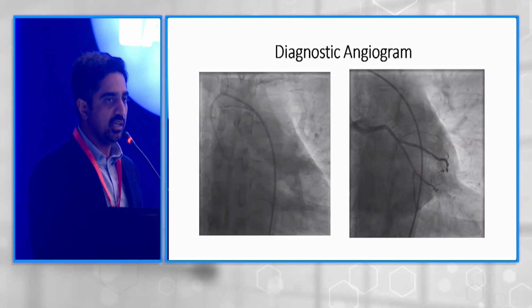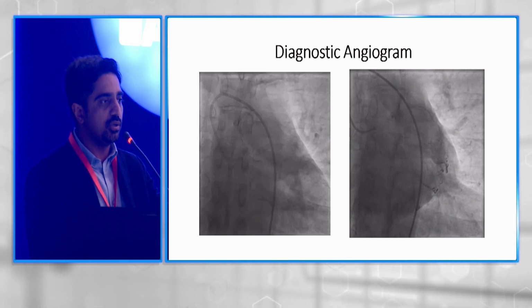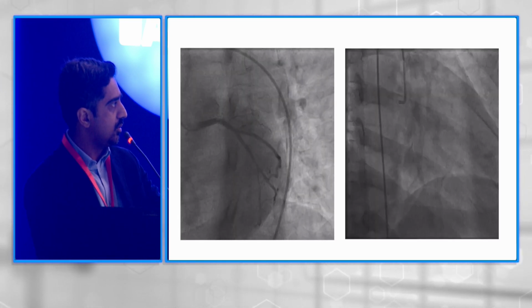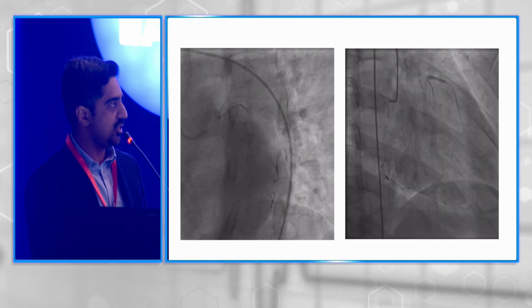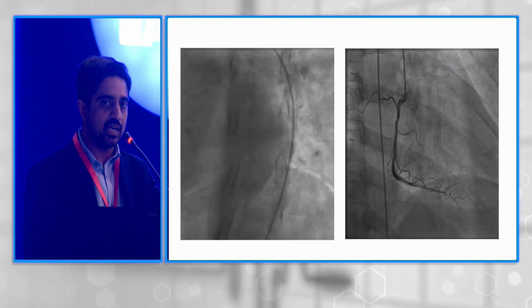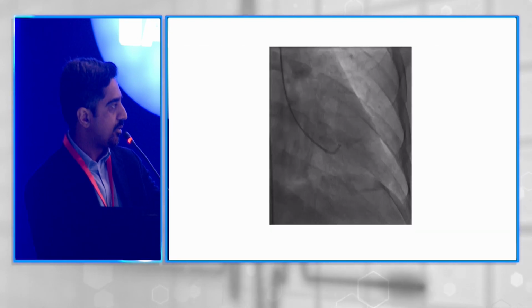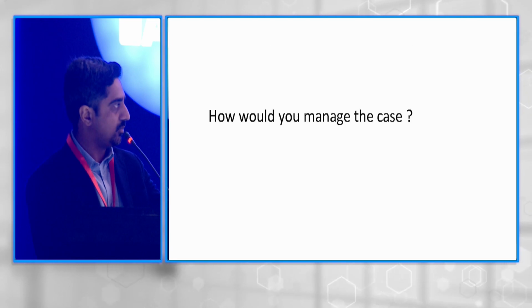So the patient didn't infarct this time. Our supposition was that this was a gradual restenosis, not stent thrombosis, because the stent was placed in 2015. And if you look at these RCA injections, you can see that the LAD is filling retrogradely, showing that the LAD has been collateralized over time, and this was a gradual restenosis getting up to the total blockage of the stent. And the LV is also preserved, so it has not infarcted.